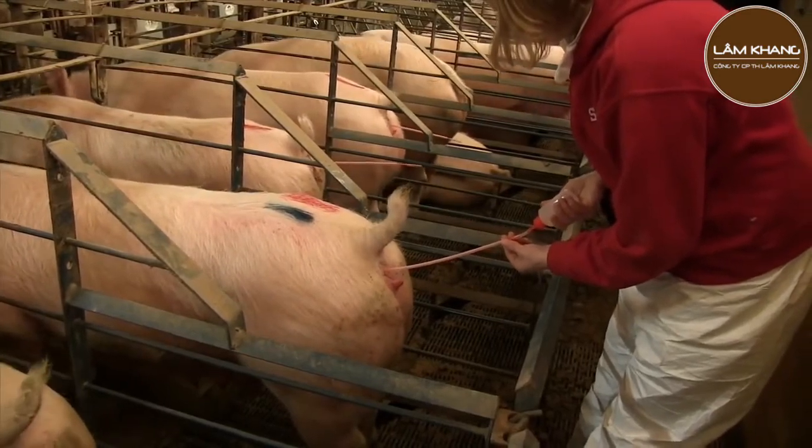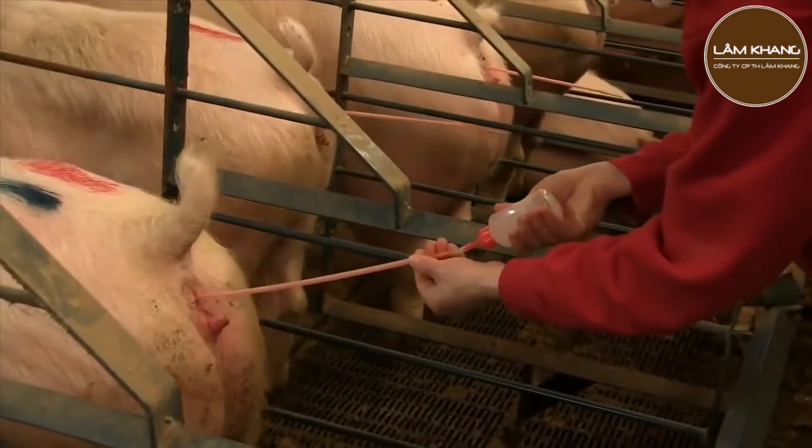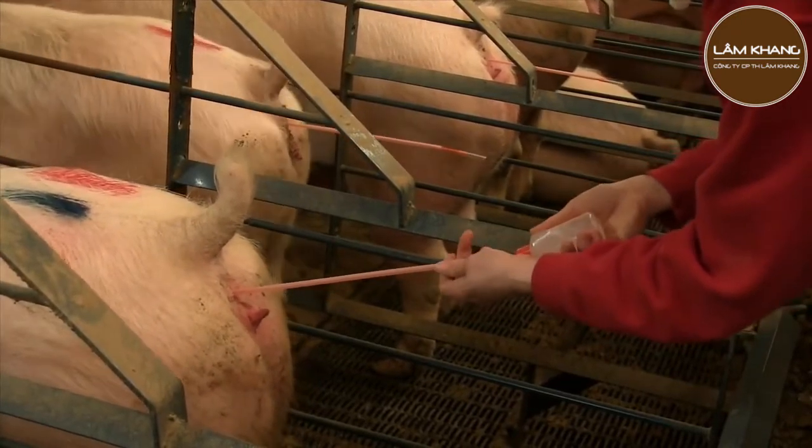Sometimes the end of the inner catheter that's in the sow's uterus may suction against the wall of the uterus. This would be evident if the semen was not flowing out of the bag or bottle. If so, you can pull back on the inner catheter slightly and semen should begin to flow.